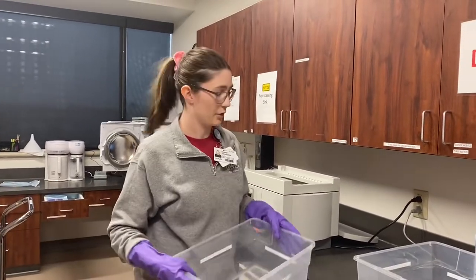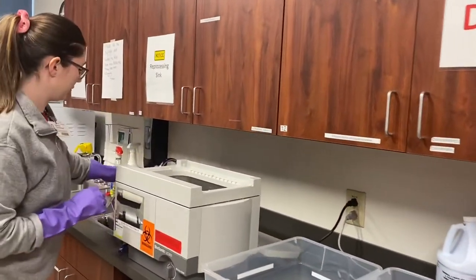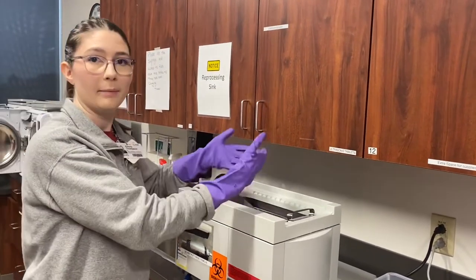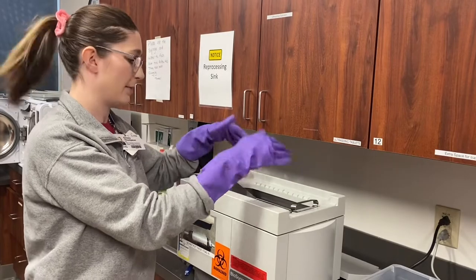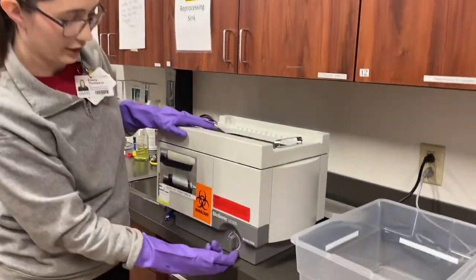When you come into the sterilization room you can set it here and then you put the instruments into the ultrasonic machine. Cassettes need to be buttoned up and then all other instruments can just be thrown in, and then you're going to make sure this is full and then turn the knob to 15 minutes.